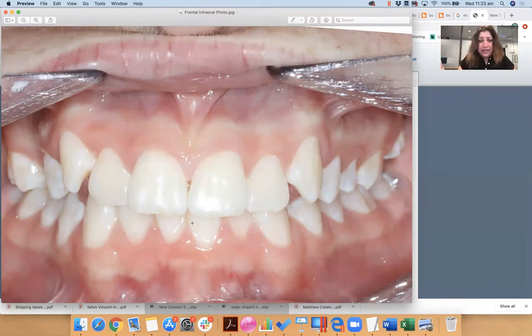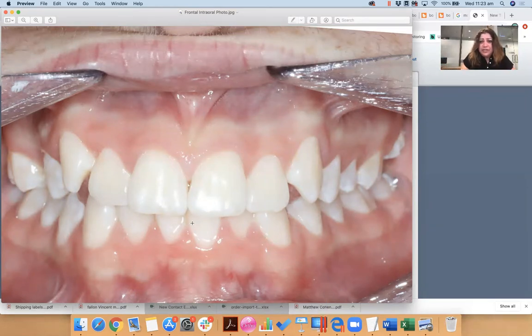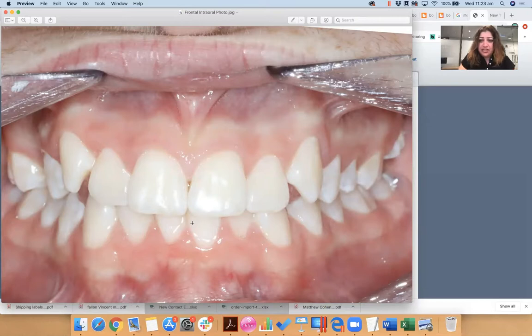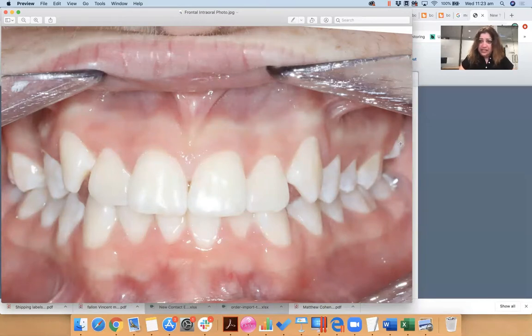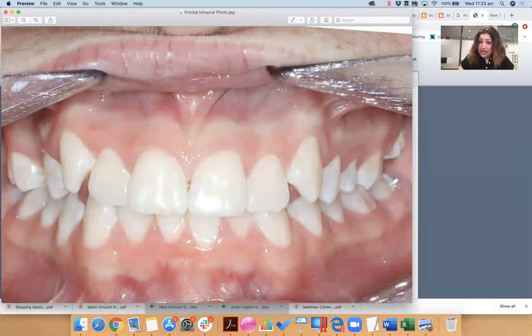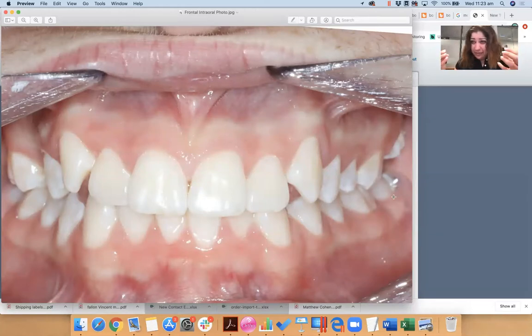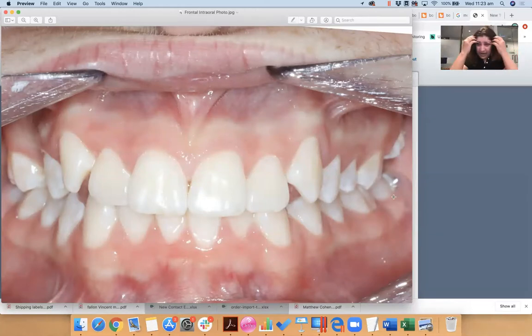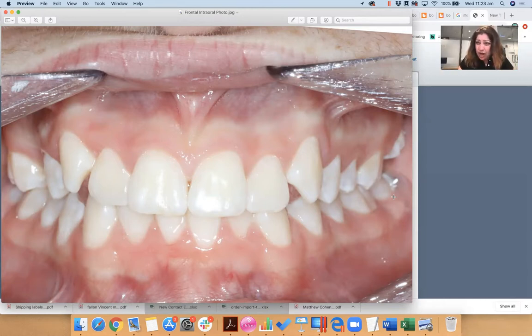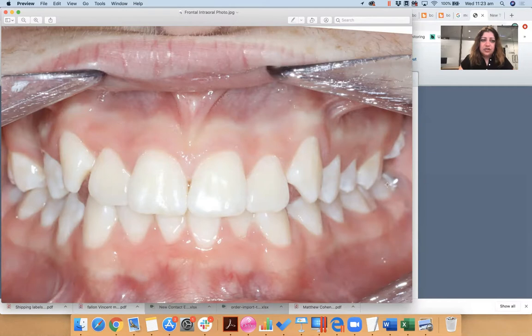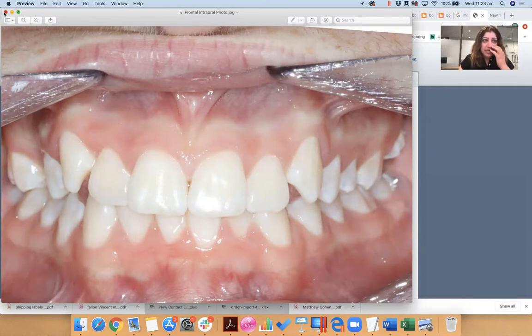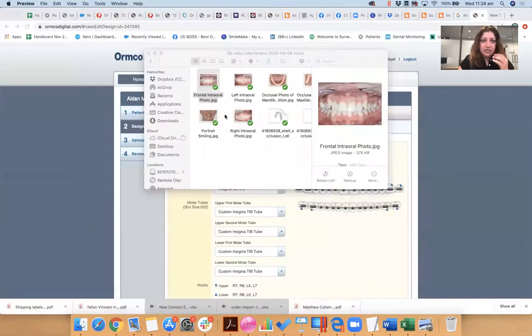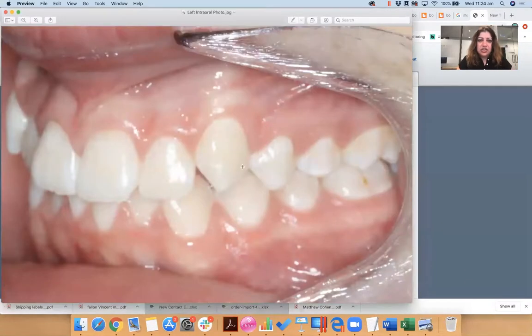You've got to pretty much tell the technician here what you want to do. So you can see the seven is not erupted here. Now the technician may not be able to bond the seven bracket straight away, but if your intention is to erupt 1-7, 2-7, let the technician know, okay? Let's look at the buccal occlusion for this case.